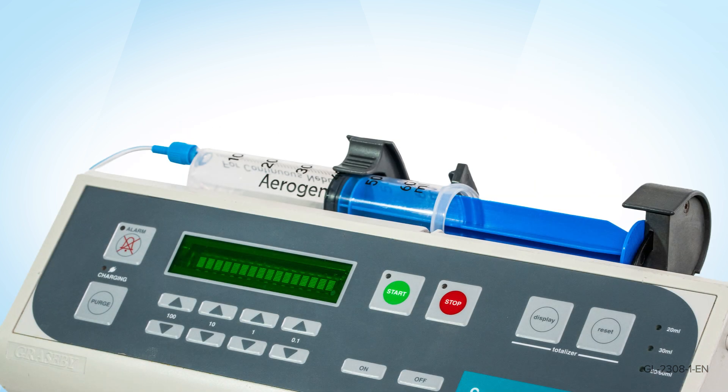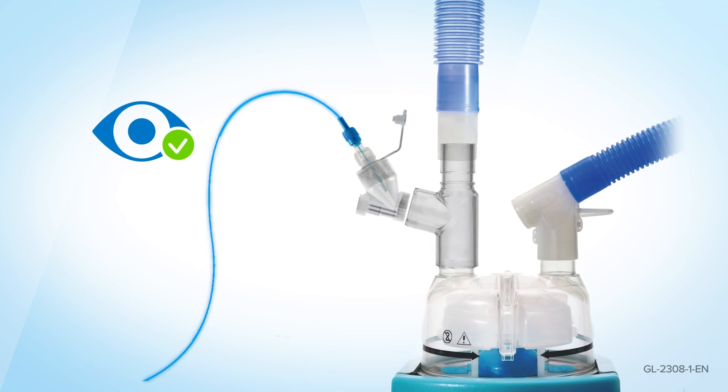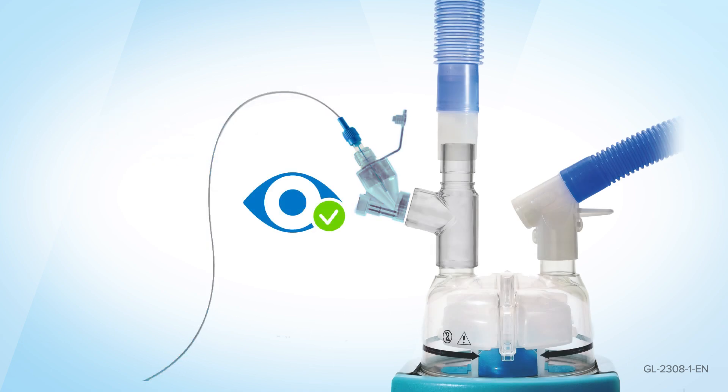Visually check that there is no air in the syringe, no air in the line, and no medication in the Aerogen Solo.